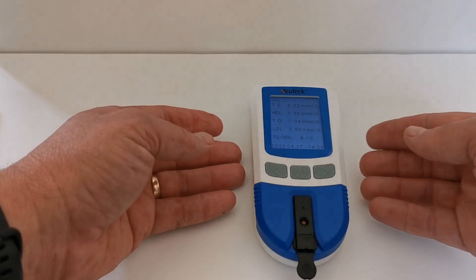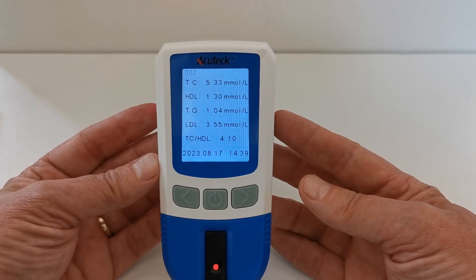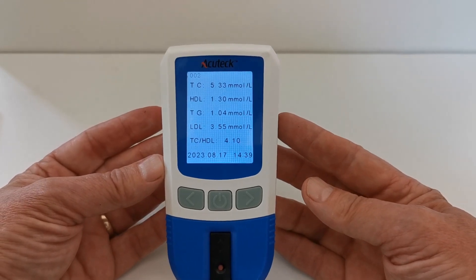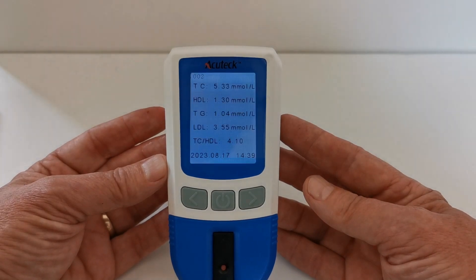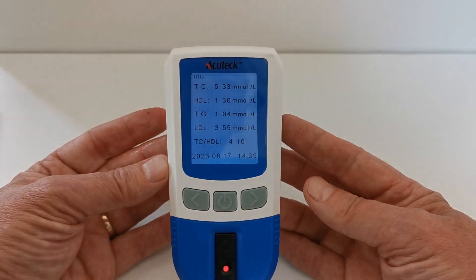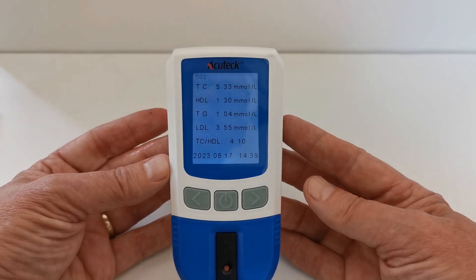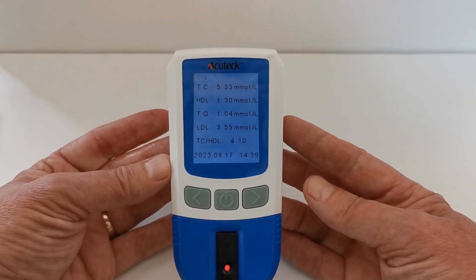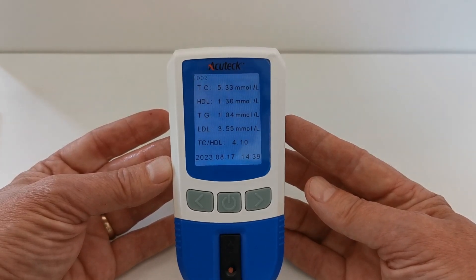I have the cholesterol results showing now on the display. The total cholesterol is 5.3 millimoles per liter. HDL is 1.3. Total triglycerides 1.04, and LDL is 3.55. The total cholesterol to HDL ratio is 4.10. The time and date, as demonstrated, are all recorded in the memory on this meter.